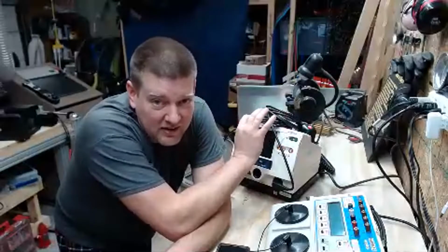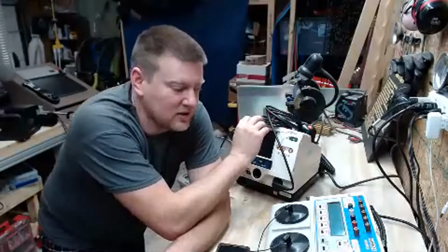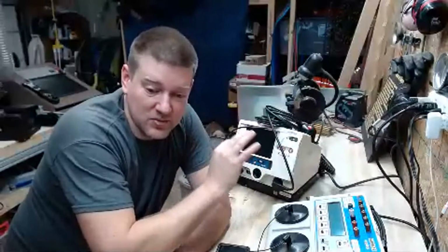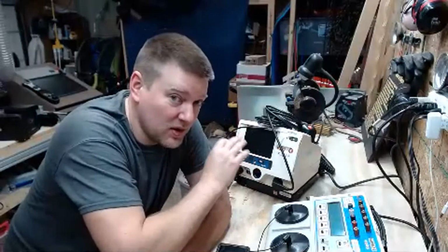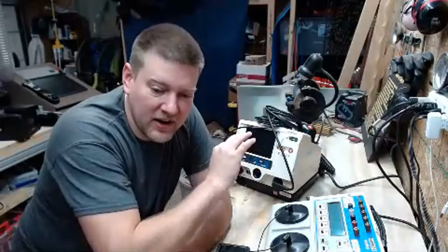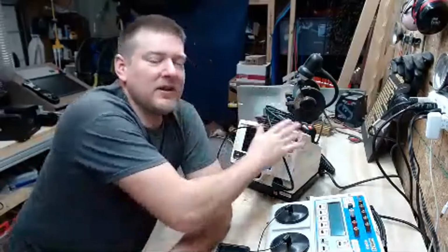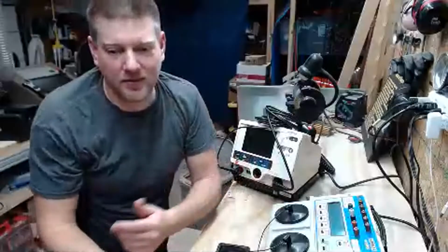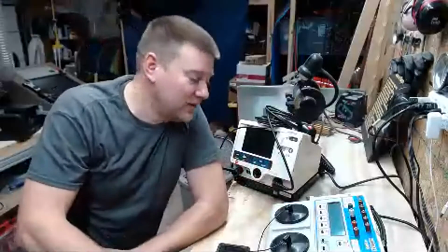Do not give it back to the customer and put it back in service if there's any question whatsoever of its reliability. And if it was used on a patient and there's a situation, I don't care if it was user error or not, ship the defib back to the manufacturer and have them give you a full write-up. I'm telling you, do it.